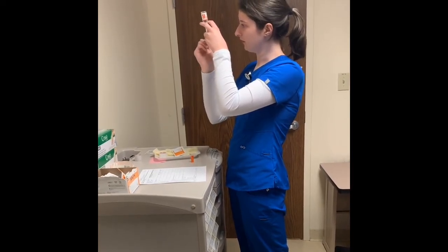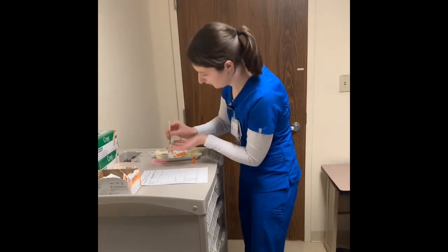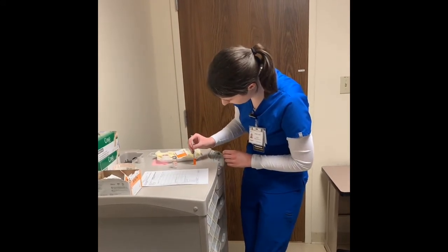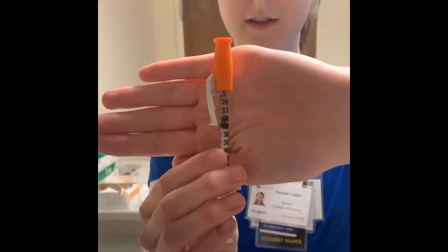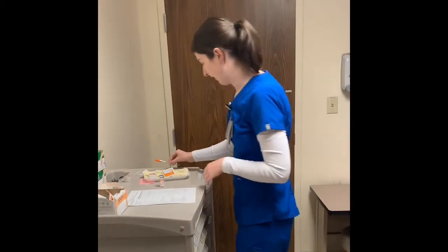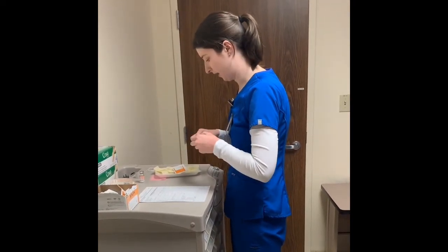There's a little bit of extra liquid in here, so I'm going to go ahead and, okay. And I can remove my needle and do a one-handed recap. Okay, and here we are. I have prepared 20 units of regular insulin. All right, now I'm going to set this to the side, and I'm going to go ahead and make my label to go onto the medication that has been prepared.